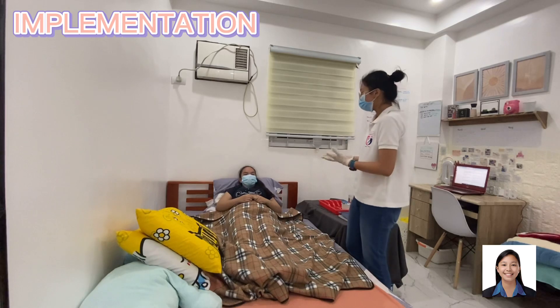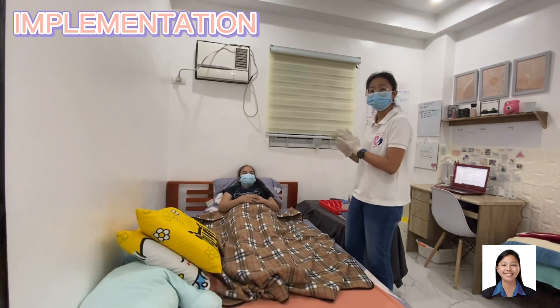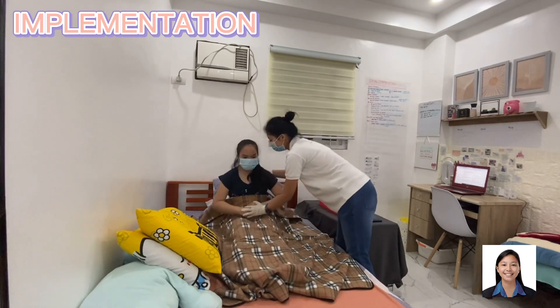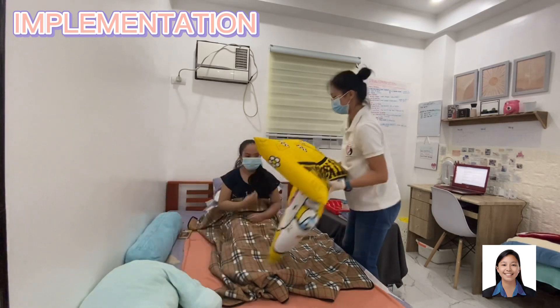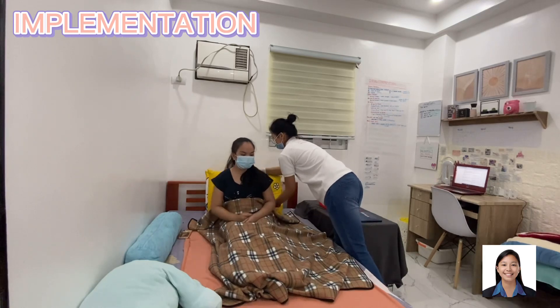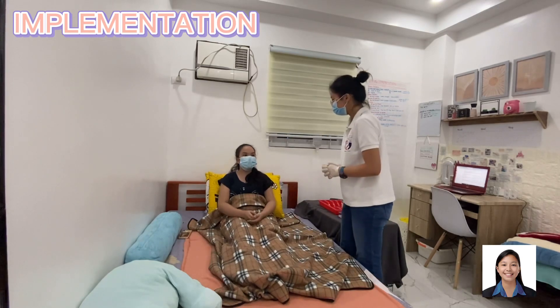Next, position the patient into an upright position. You can also position your patient into a lateral position. Okay ma'am, let me assist you. Are you comfortable with that position, ma'am? Yes, nurse.